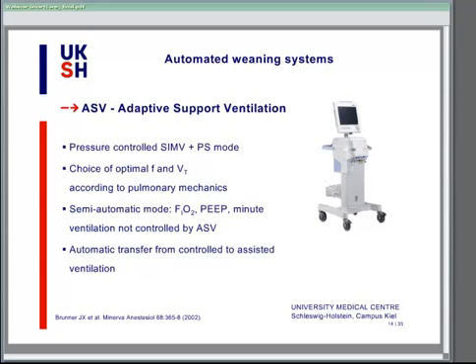It is a semi-automatic mode, so the user has to set the inspired fraction of oxygen, the positive end-expiratory pressure, and the minute ventilation by hand. But the system is a very nice tool for an automatic transfer from controlled to assisted ventilation, for example, for patients recovering from general anesthesia.